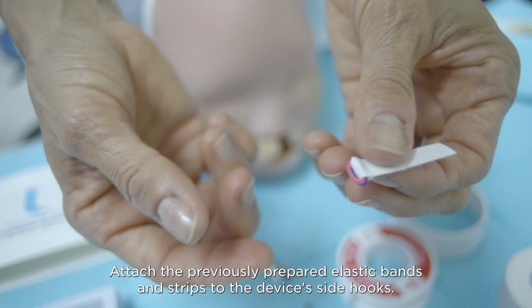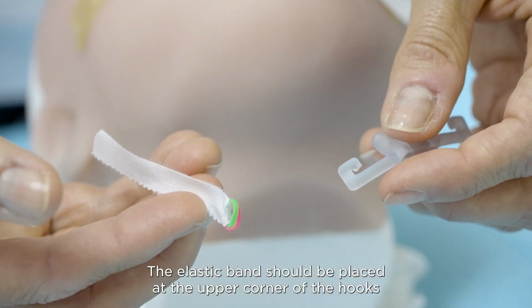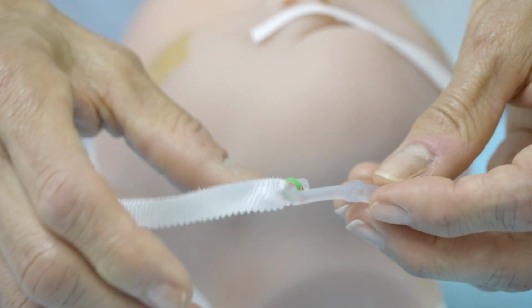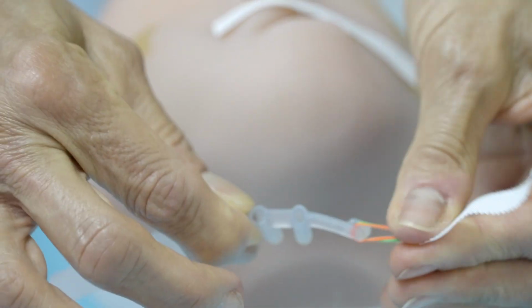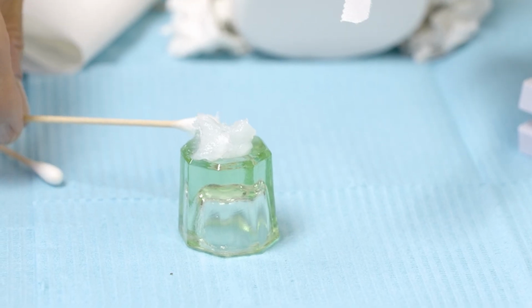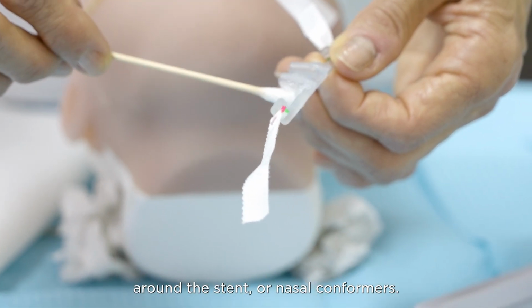Attach the previously prepared elastic bands and strips to the device's side hooks. The elastic band should be placed at the upper corner of the hooks to avoid appliance rotation. Using a cotton swab, apply a small amount of petroleum jelly around the stents or nasal conformers.